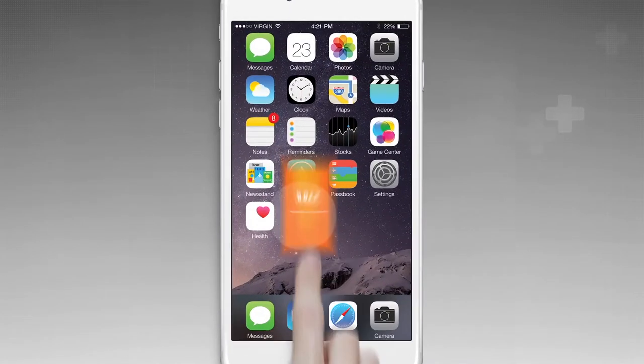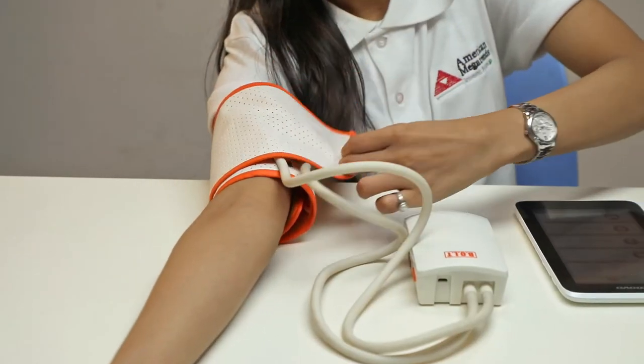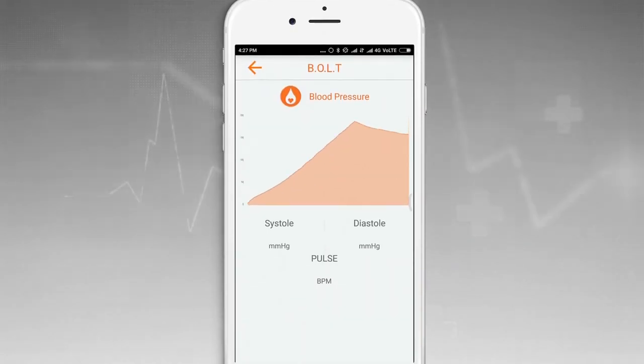Now, launch the Bolt application. Position the Bolt cuff on your upper right arm about 1 inch or 2 cm above your elbow. Select the Blood Pressure option in the app.